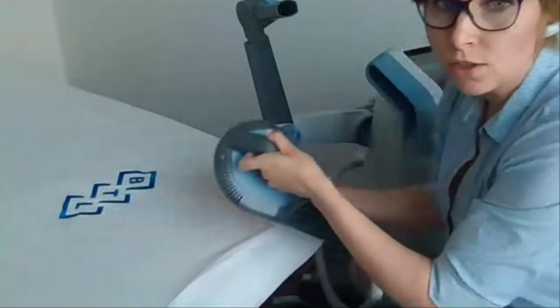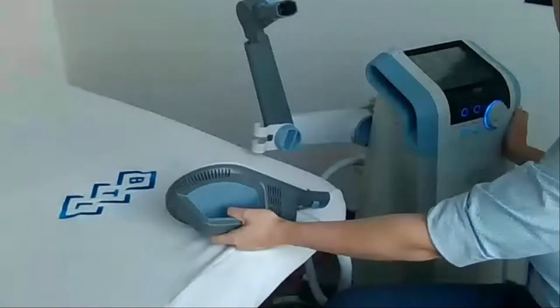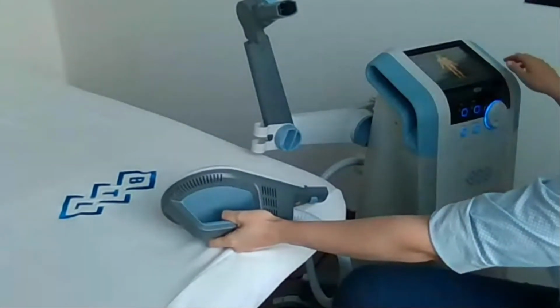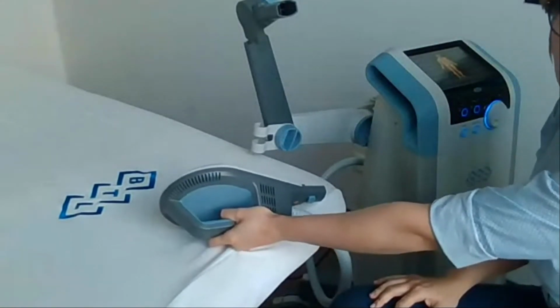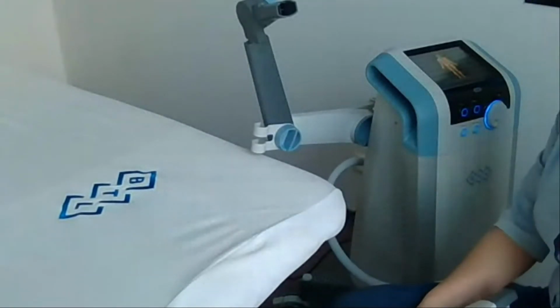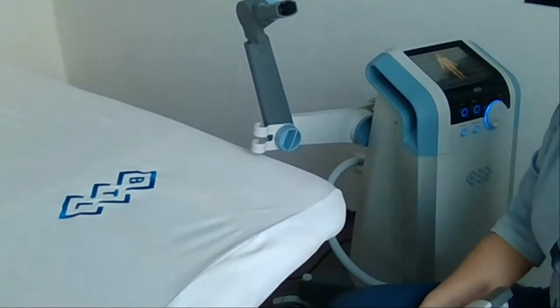Okay, so let's change the protocol. And we can do this easily. I hope you can see it. We can do this easily with our screen. I am sure that most of you had opportunity to work with the BTL devices, and every BTL device is created in this way to make it the easiest to set the therapy on.